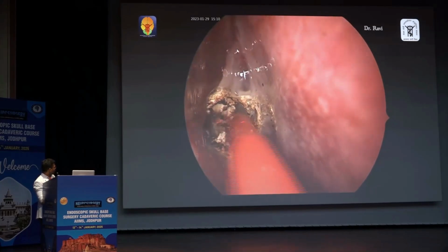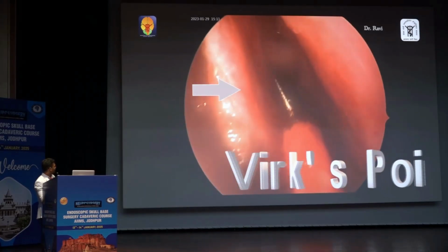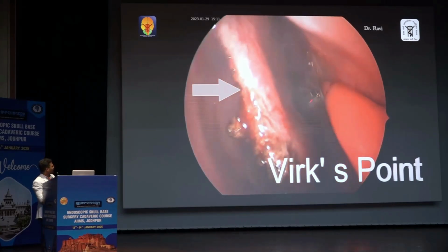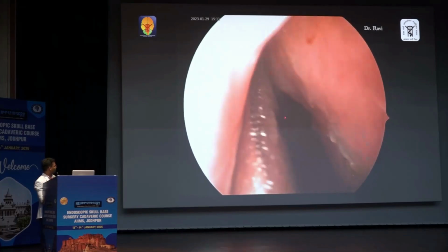And once you make the incision, always go slightly laterally. It will give better rotation. Okay, this is a slight lateral incision. And I follow the ostium and the midpoint of the middle turbinate. I just do that vertical incision. So I am 100% sure that the olfactory mucosa was preserved.